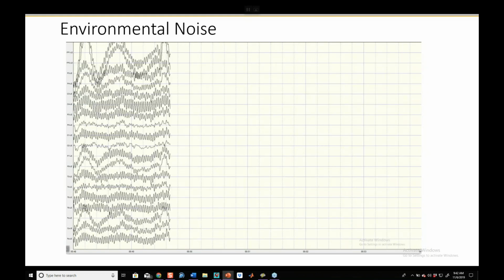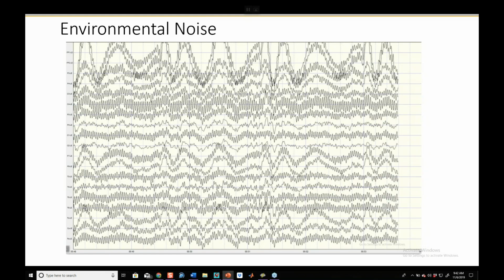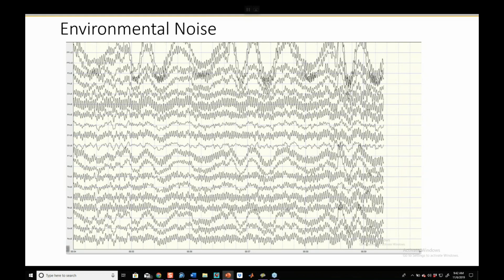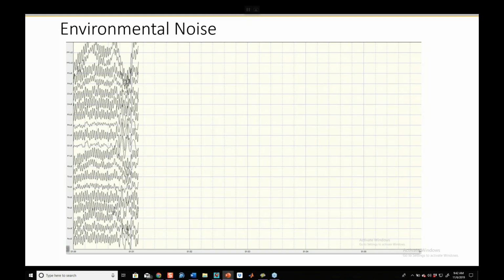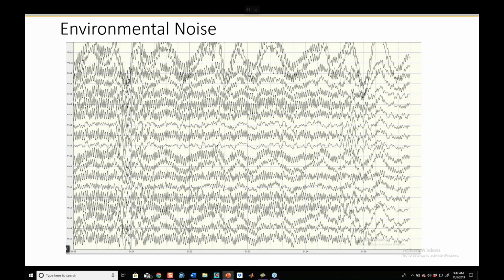This isn't quite right. And you know, after seeing enough of them, you'll say, oh, this is electricity in the EEG. It happens more often than not. There's some ways around it. There's grounding mats. You know, I've known people to have actually done work on the structure themselves. I highly recommend, if you're moving into a new office, though, you go in with a cap on and your amp in hand, and you move from room to room, and you make sure that you don't have electrical contamination, because it can really muck up your data.